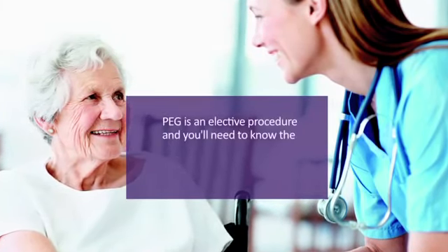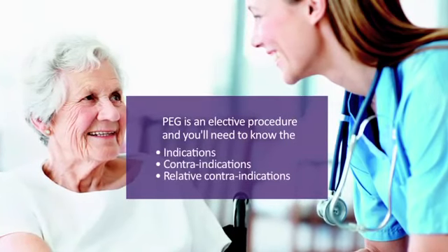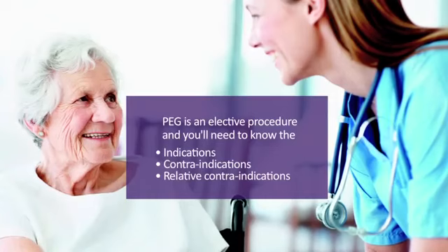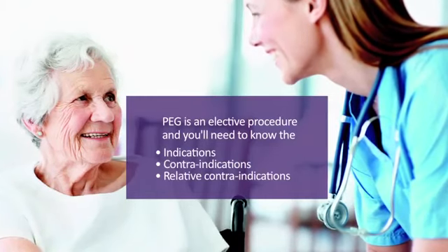PEG is an elective procedure and you'll need to know the indications, contraindications and relative contraindications when deciding which method of insertion for creating a gastrostomy is clinically preferred for your patient.